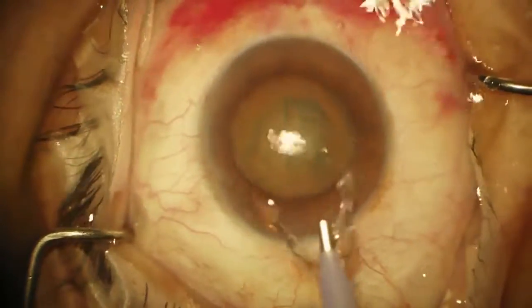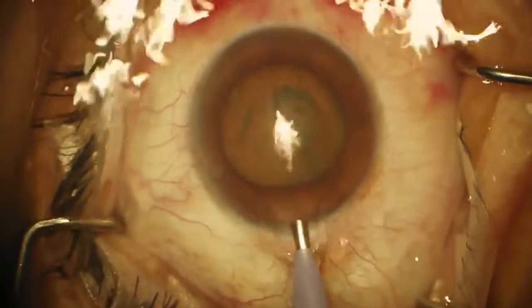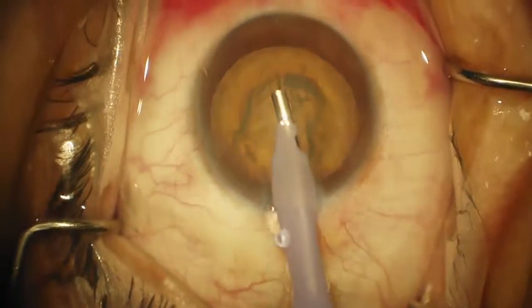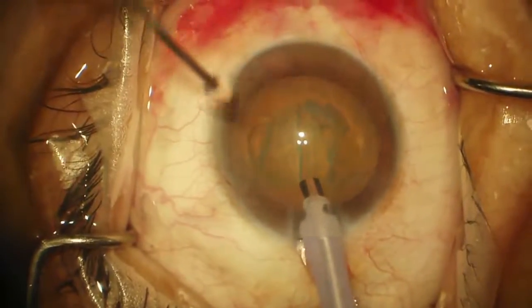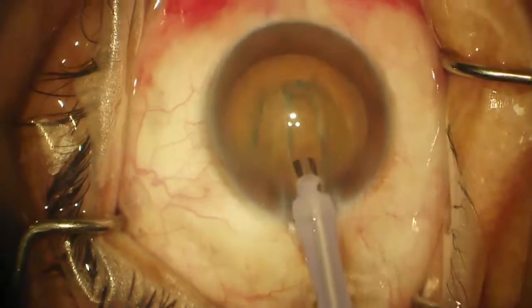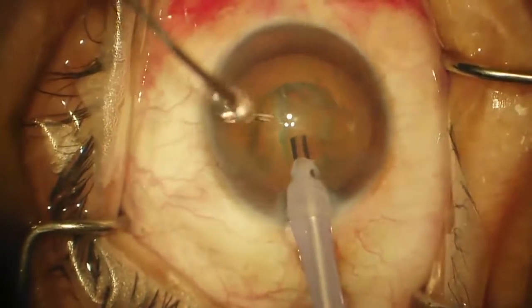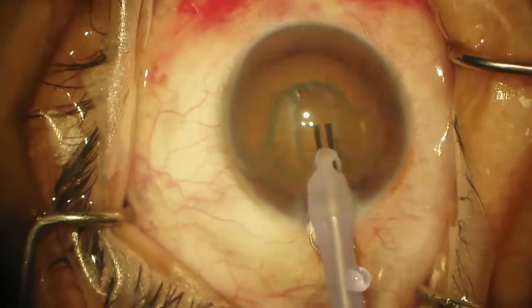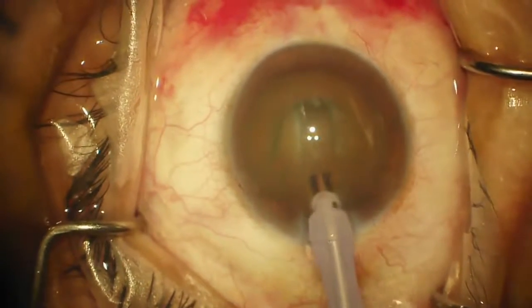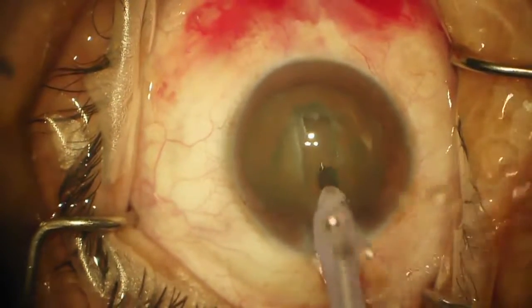I like to go in on continuous irrigation so you don't have to worry about coming off the foot pedal and shallowing the chamber. You sculpt and you only turn on the phaco — only go to foot position three. The first thing I did is make it wide enough, and I always check my parameters to make sure they are what I want them to be. We're in sculpt mode with vacuum linear up to 90 and flow rate set at 24.